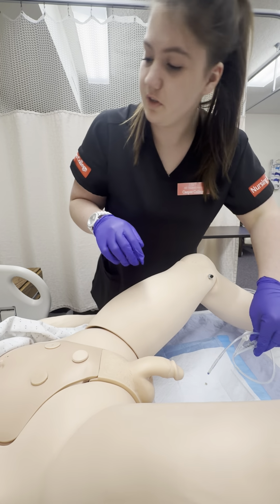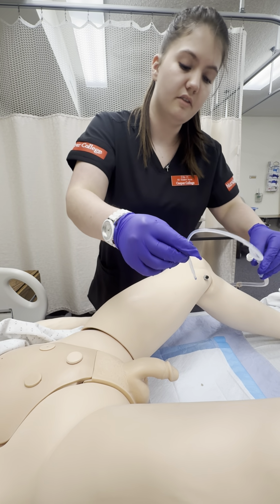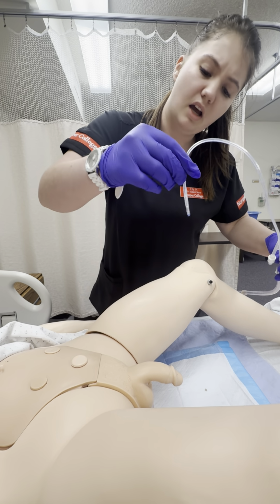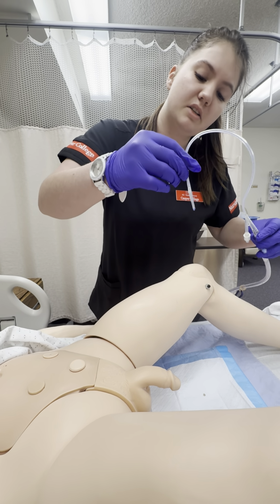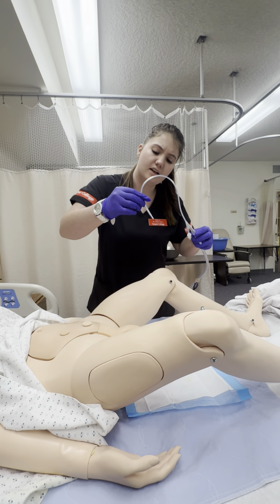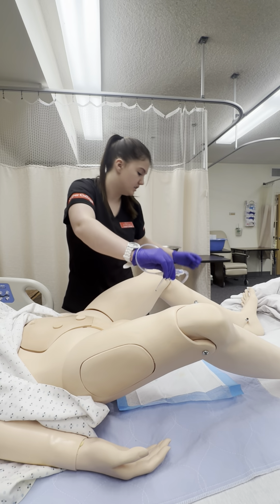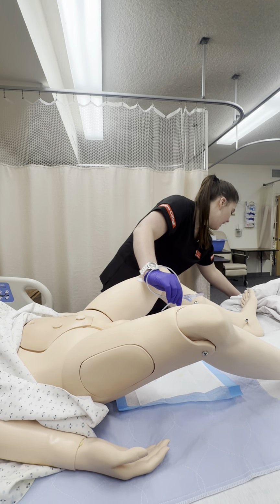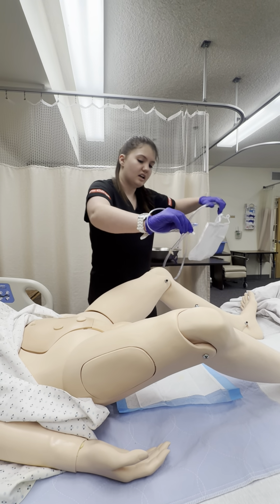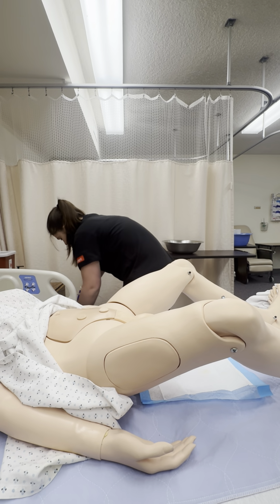Great, awesome. You still feeling okay? Yeah. Okay, all right, I'm gonna go ahead and observe the intactness of the tube. I'm not seeing, looks like we got all of it out. I'm not seeing any blood, mucus, any signs of infection. It looks like the tube is fully intact. So I'm gonna go ahead and grab this bag that is still anchored to the side of the bed, and I'm gonna dispose this as per facility policy.